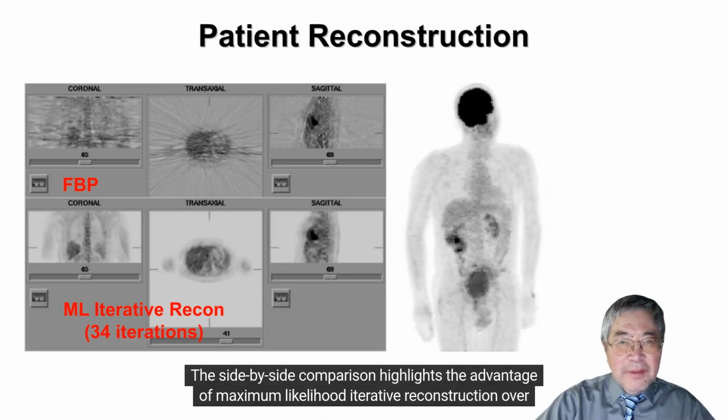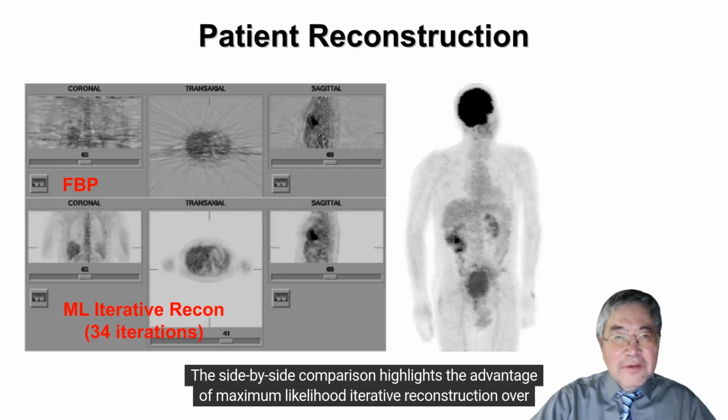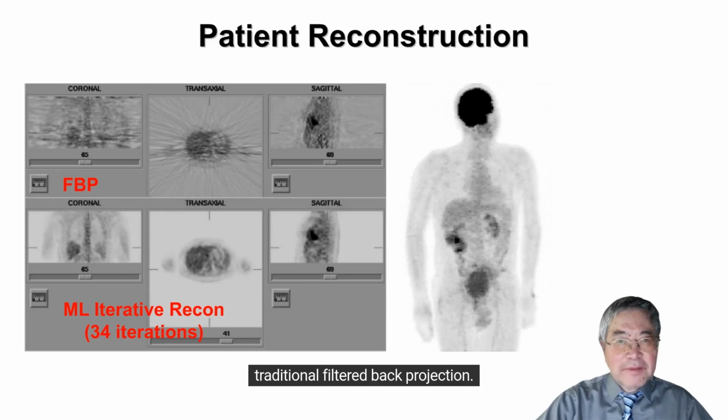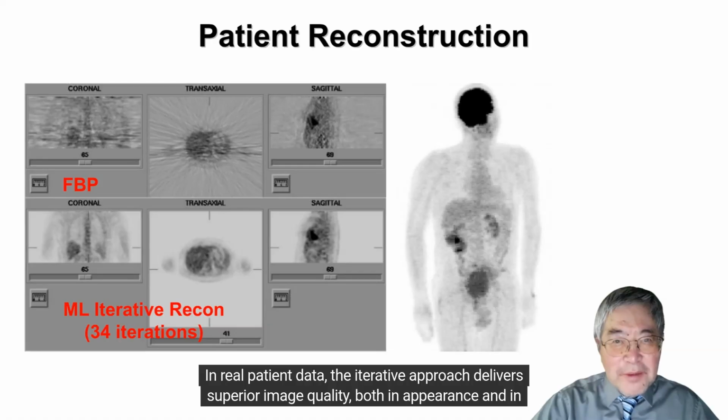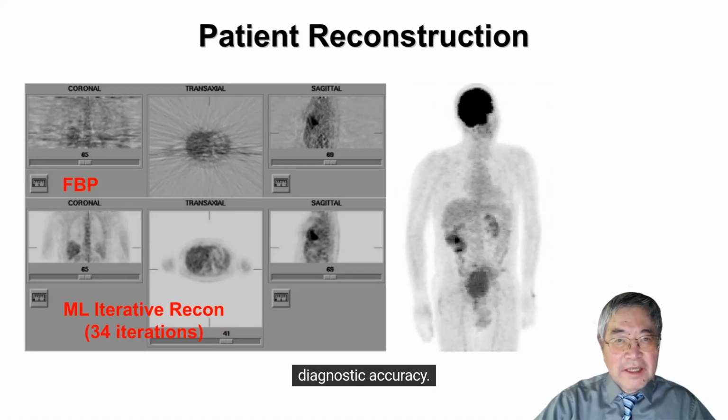The side-by-side comparison highlights the advantage of maximum likelihood iterative reconstruction over traditional filtered back projection. In real patient data, the iterative approach delivers superior image quality, both in appearance and in diagnostic accuracy.